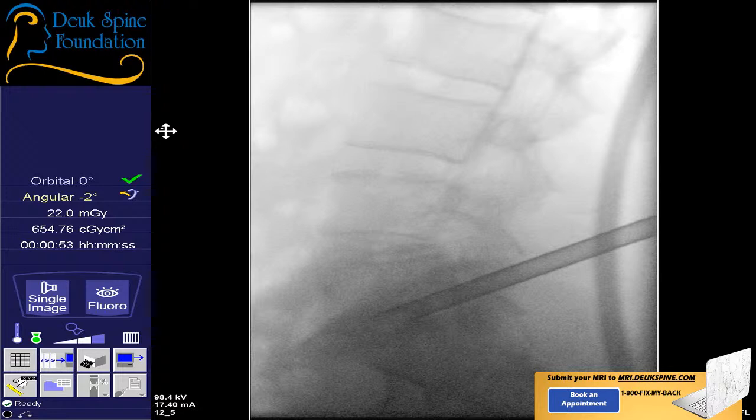I'll be done in 5 minutes. So now this thing here is scar tissue, right here. That's from the herniation and inflammation, just massive, massive inflammation right around the nerve root. That's actually attached just below the nerve root. Then you got the end plate, which is that orangey, reddish color over there. That's the L5 end plate. Then you've got the S1 end plate on my left at 9 o'clock. But the blue thing right here, that's the herniation. That's the annular tear. That's really what we're after right there. That's what's going to take the pain away.